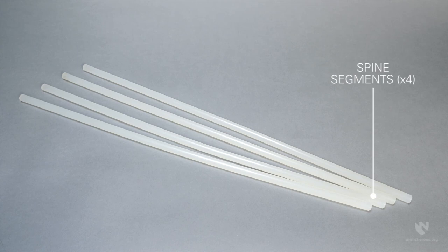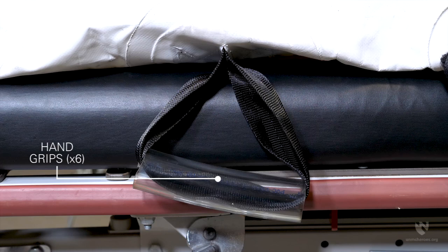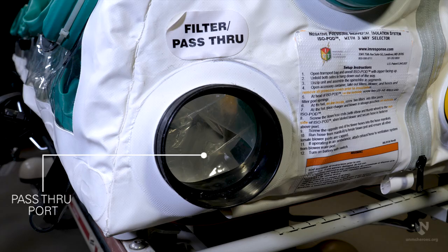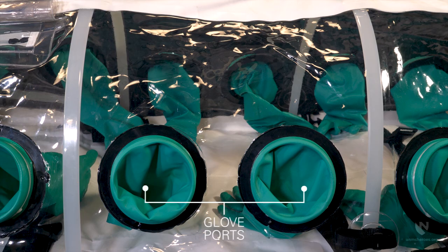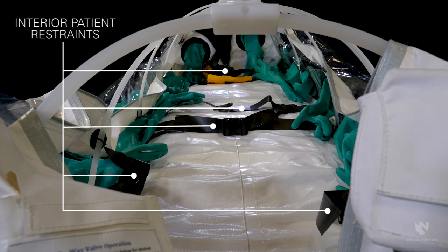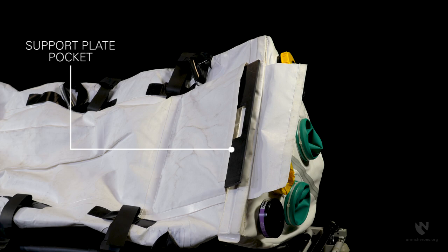Additional features include four plastic spine segments, transport straps, hand grips, a pass-through port, a vertical drop bag, glove ports, interior patient restraint straps, a spine board pocket, and a support plate pocket.